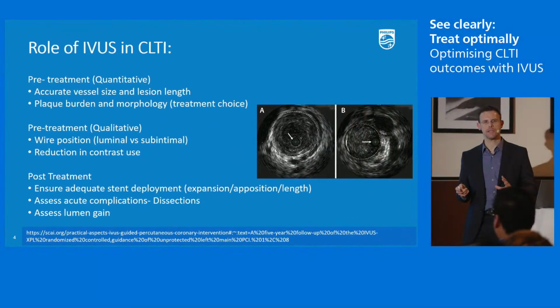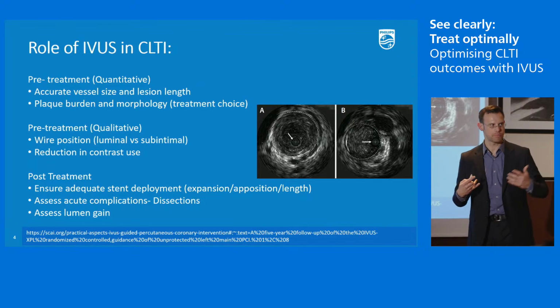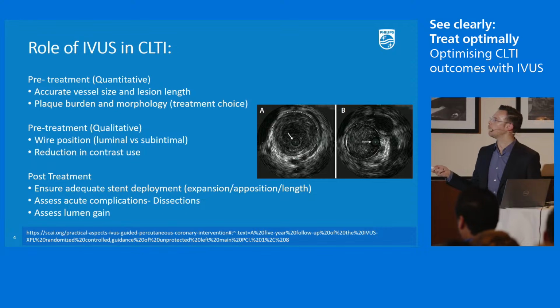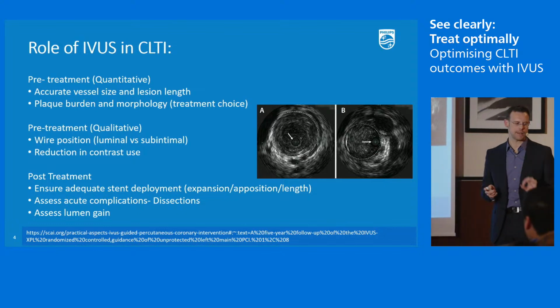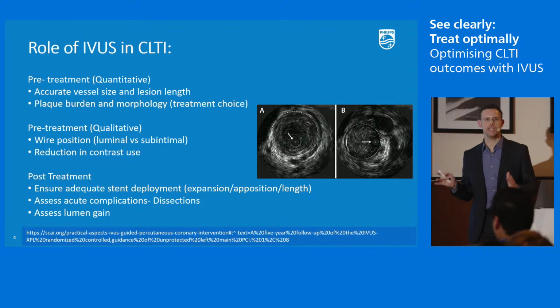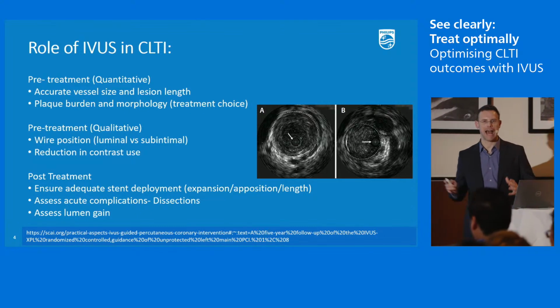I learned this and it stood me in good stead, and I want to teach you as I learned it, probably from what I heard from NT and Ash teaching in the past. It's about what information we can get at each stage of our procedure. And I'll go into this in just a slightly different way. So if you're thinking about the pre-treatment evaluation, we can accurately size the vessel and the length of the lesion.